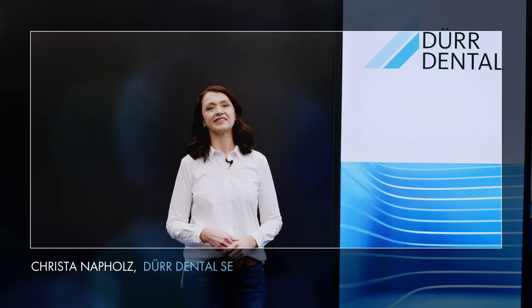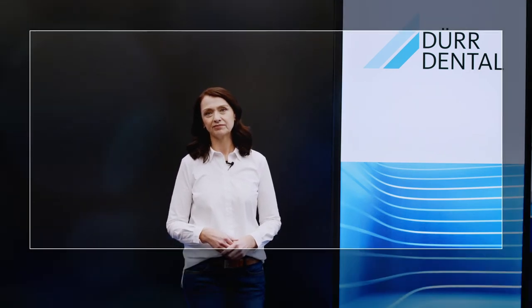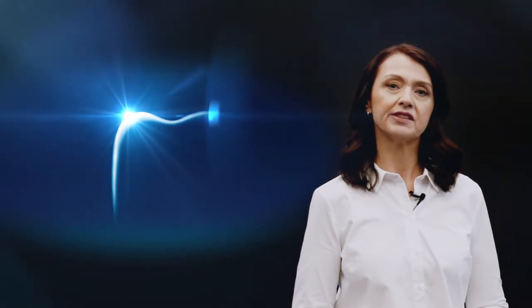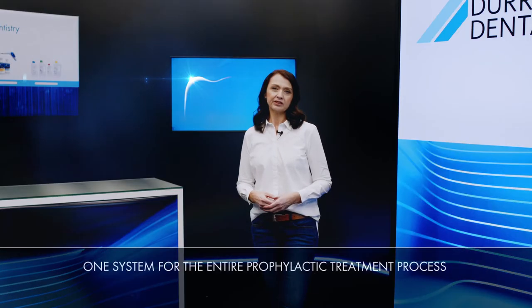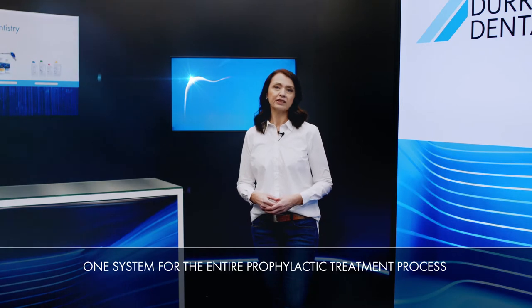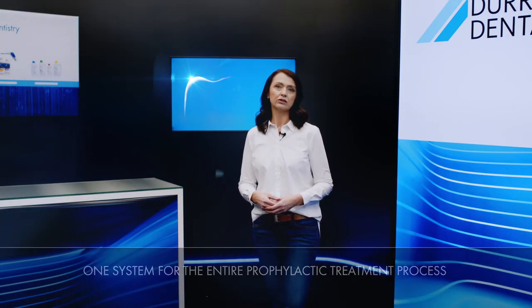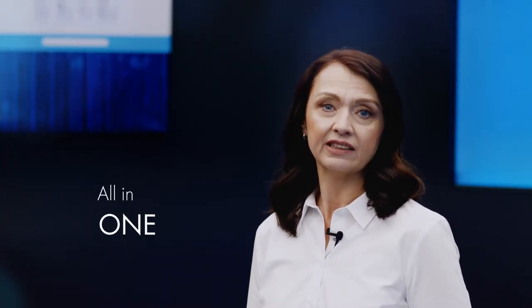Hello, my name is Krista Napholz and I'm here today to show you the LUNOS range of prophylaxis products. The LUNOS brand represents a portfolio of matching products, all combined in a single system. That means the LUNOS range offers units, consumables and useful accessories for virtually everything that happens during a prophylactic treatment session. And this all-in-one design is exactly why it's such a great choice.